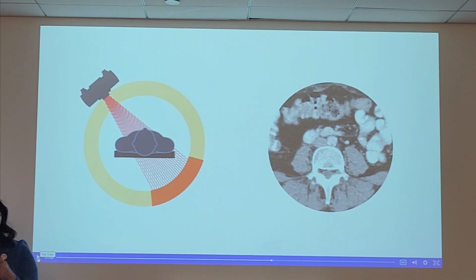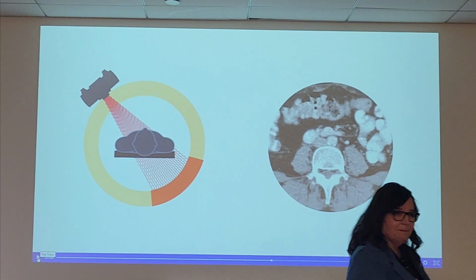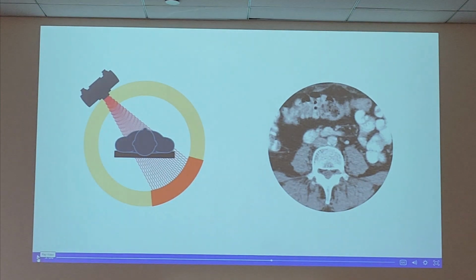Absorbed, which would be stopped. Or deflected. Phone a friend. Please, this is a democracy here. We can phone friends. We love each other. Y'all are a small class, but a mighty class. Let's go around the table. What is attenuation? He said absorbed and scattered. High five. Yes.